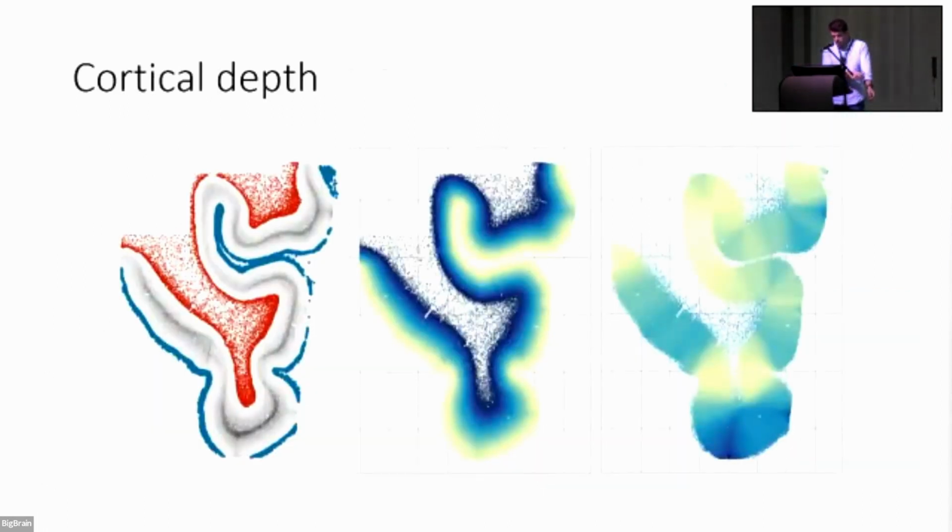I'll show you how. For instance, here it's very easy to segment layer 1, or to better say, detect layer 1 and white matter neurons, because of course these white matter neurons have a very large sparse area around them, but layer 1 neurons are packed between the outside of the slide and layer 2 neurons.